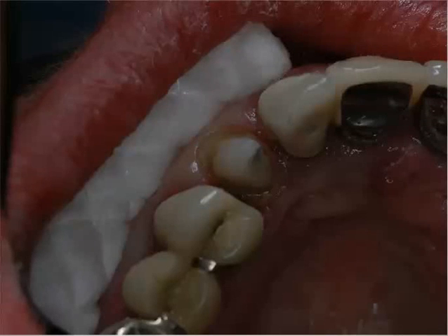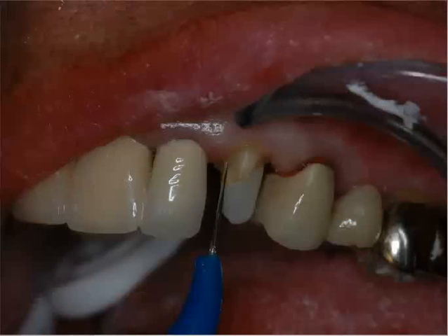But you can see this. We've already done our post-in core. We've done our initial preparation. Now we're going to go ahead. We're going to trough around, especially the interdental papillary, get at least 2 to 3 millimeters below that to support the post-in core.